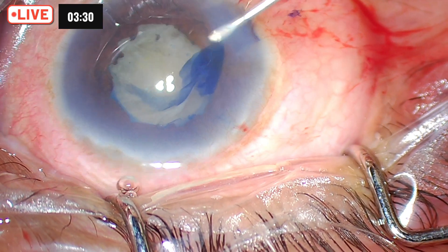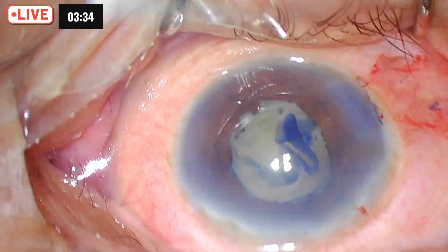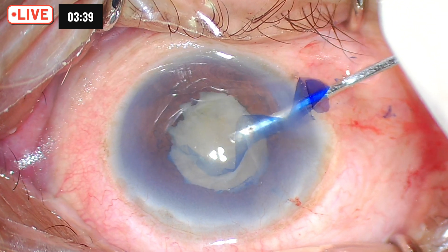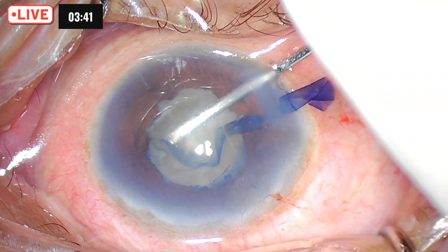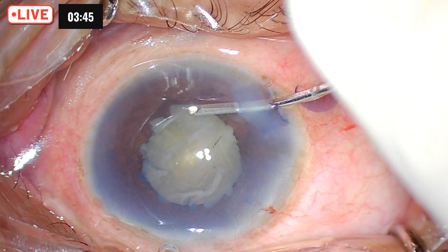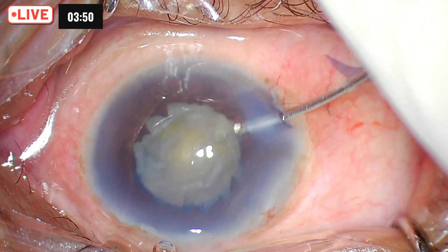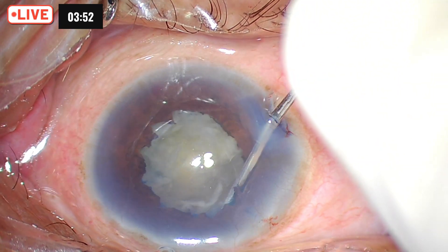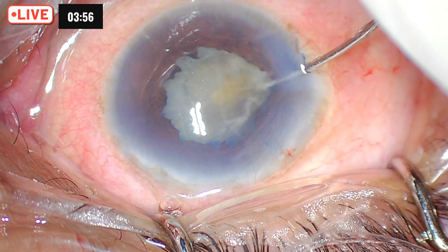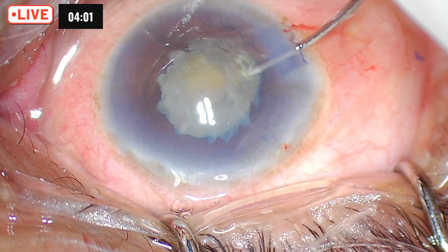I have gone behind the iris and made my rhexis complete. The next thing is that the chopping maneuvers have to be very, very careful in these patients, because this is a mature cataract with very brittle zonules, and on top of that the patient has pseudo exfoliation — so we are dealing with a double jeopardy here. Without causing much pressure on the zonules, we will do a rotation.